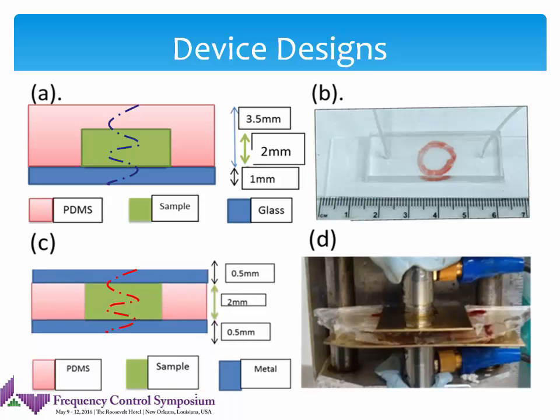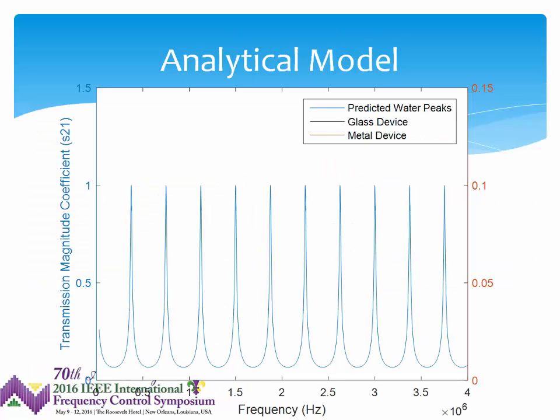And then there were a couple of microfluidic type devices built, so a PDMS on glass device that had a channel that was a little bit larger to accommodate the lower frequency transducers. And then because you also have issues in terms of the resonances being set up across the glass PDMS layer, and those sometimes do interfere in that frequency range, there was another device that was built with metal sheets that sandwich the microfluidic device in between.